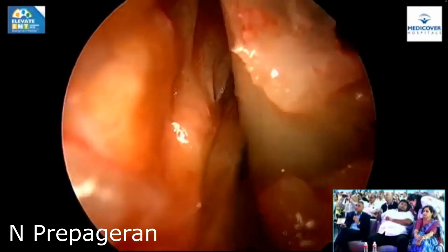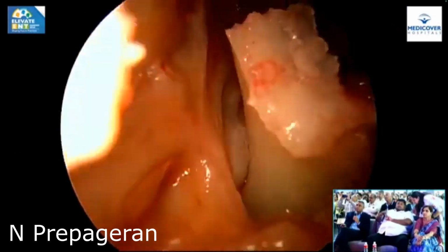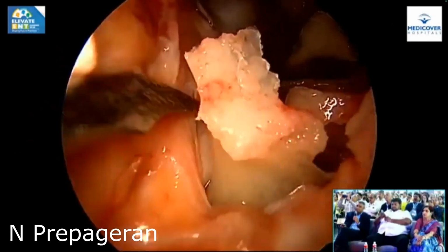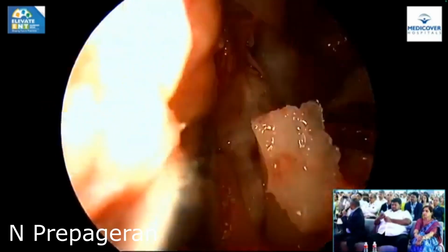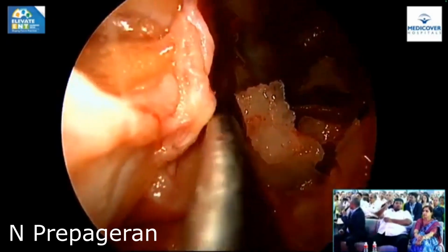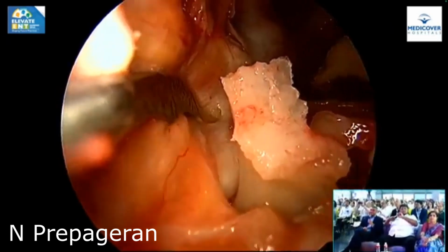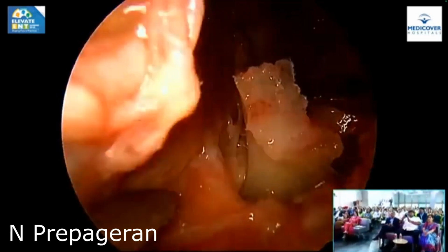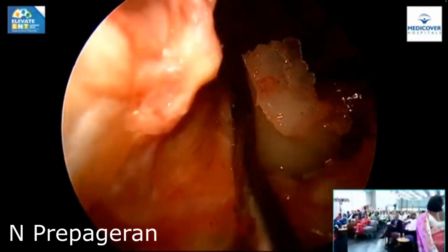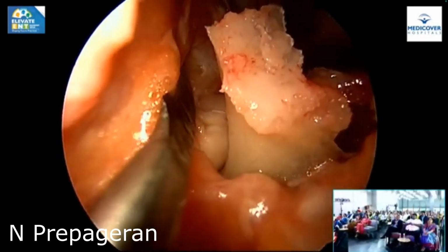Above this, that's V2. Can you see the bone here? No, not that. Between, let me dissect a little bit more. I request the audience to pose questions, if any, please. There, guys. V2, the bone in between, which is the maxillary strut, and you can see the superior orbital fissure above here. So the orbital fissure above there. Clear, guys? Okay.